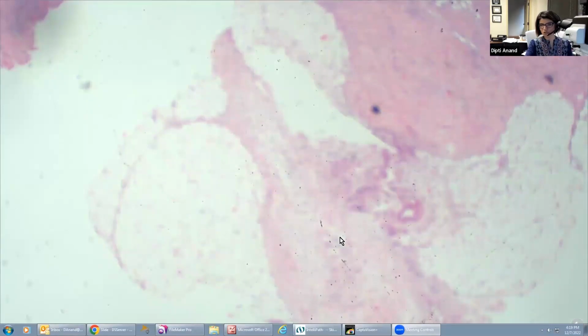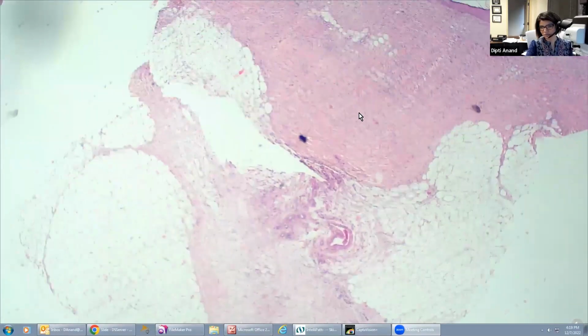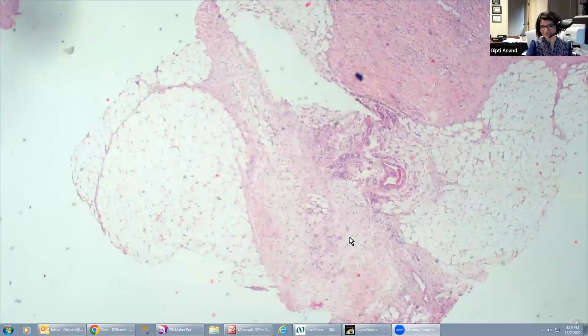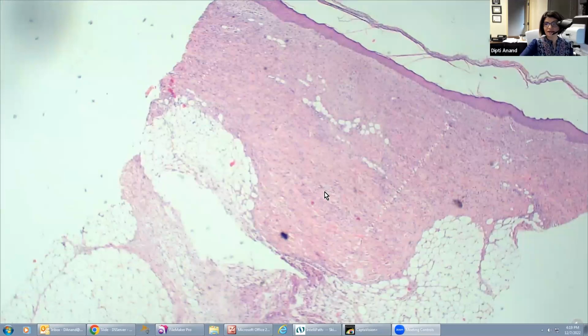So you can see in this particular biopsy, the lesional tissue is not only in the upper and the mid dermis, but you can see that the fibrosis tracks down the septum. So it presents with septal fibrosis and thickening. And unlike scleromyxedema, which is more mucinous, nephrogenic systemic fibrosis is more fibrotic. The mucin may also be absent, but it's much more fibrotic.